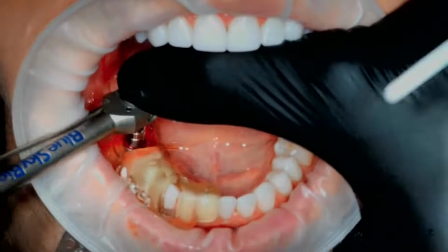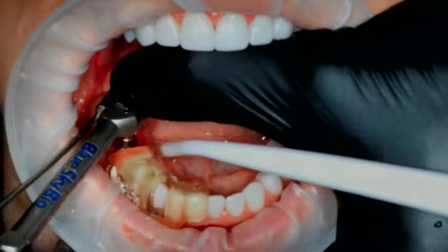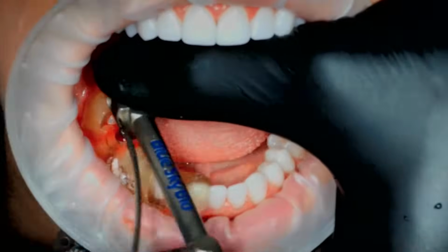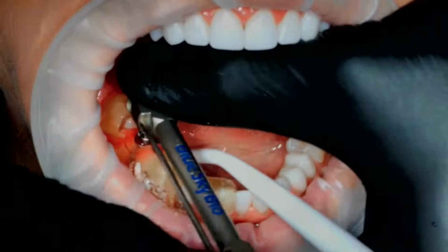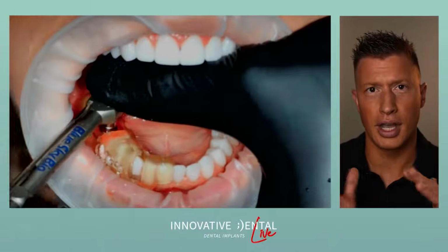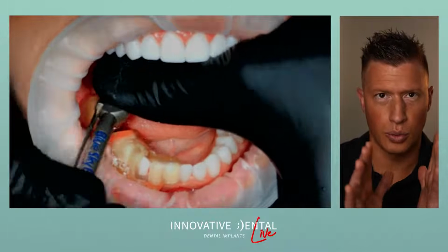Can you see it? Yeah, you can. So that line is where I'm taking that implant to, right? We want to make sure it goes down flush with that. That tells me that we've got it at the proper depth. So think about guided implants. They're not just 3D planned for angulation, but they're planned for depth.